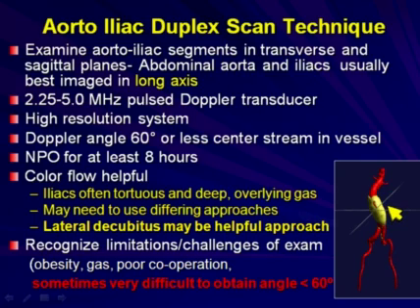You need to recognize that there are some limitations and challenges to this examination, obviously obesity, poor cooperation, and it is sometimes very difficult, due to this tortuosity, to obtain adequate angles under 60 degrees. So it requires some due diligence to do that.